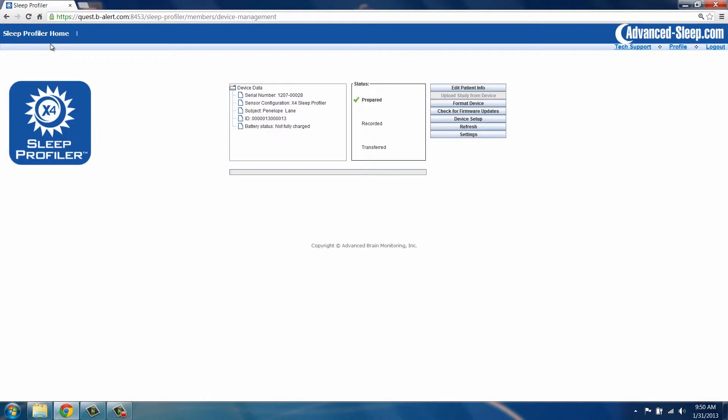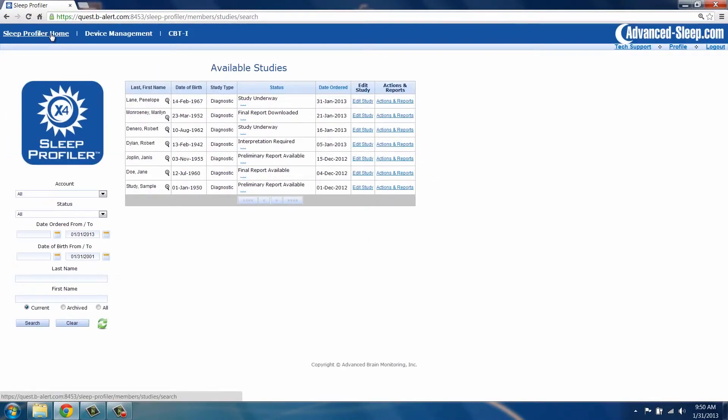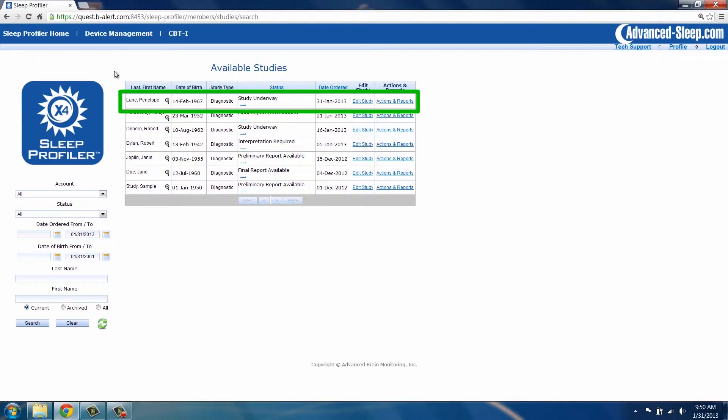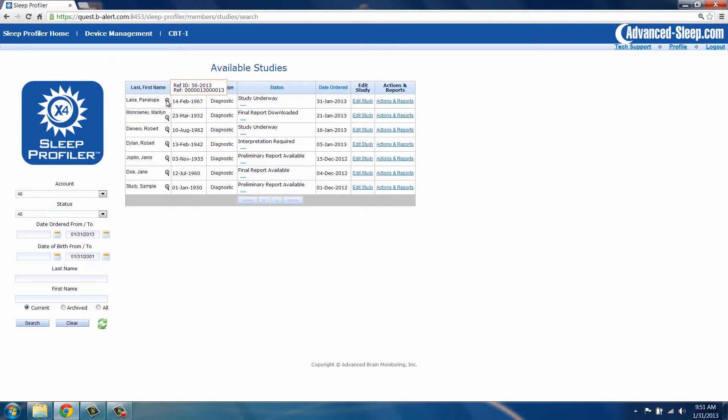Click Sleep Profiler Home. A study has now been created with the patient name and a status of study underway. To maintain patient privacy, personal information is not saved to the device. The study reference number links the study file to the patient information in the database.